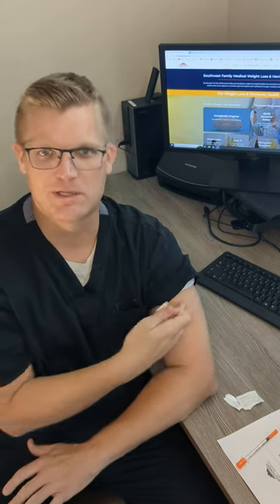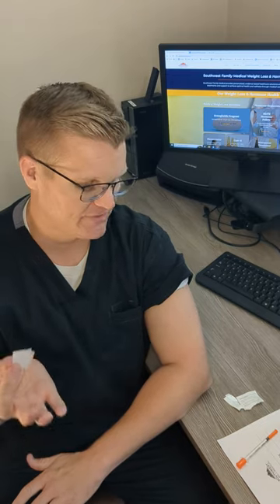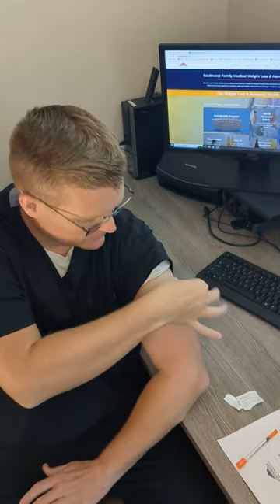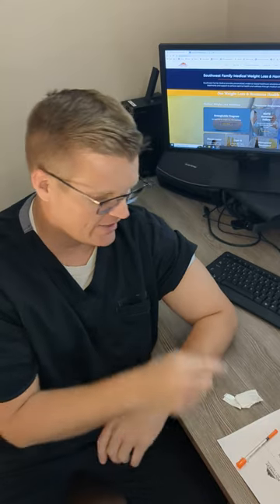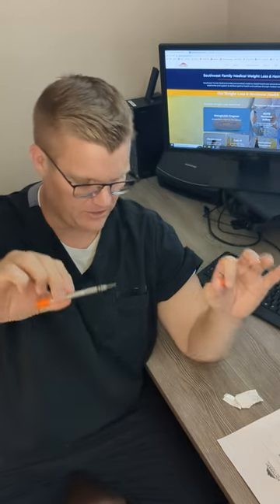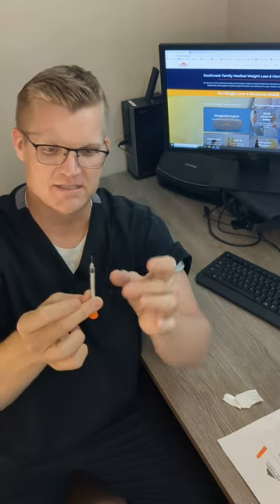I need to hit the gym more so my arms aren't super buff, but I'm just going to show you how it's done — it's very, very simple. So I'm going to clean this spot on my arm, just like that. It leaves a little wet spot right there. These needles are so small that they're even hard to see. It's no more than that long and it's so tiny.